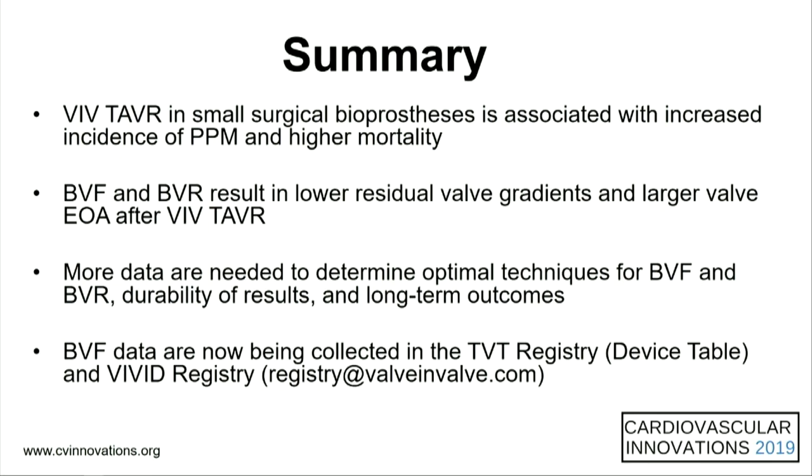I just want to point out that BVF data are now being collected in the TVT registry in the device table. If you don't know about that, we can chat about it. And Danny is collecting BVF data in the VIVID registry as well. And if you're not participating in the registry and you want to, you can email his team.